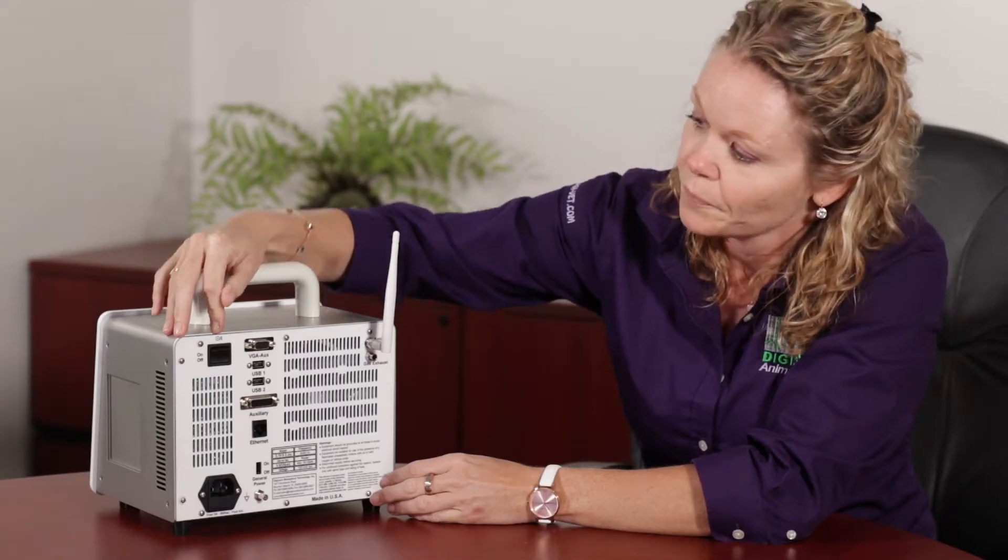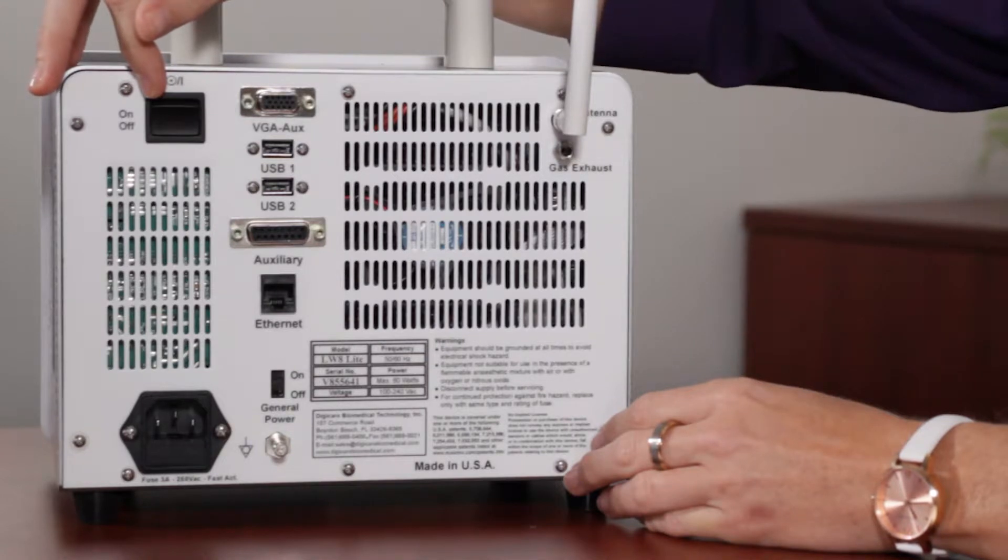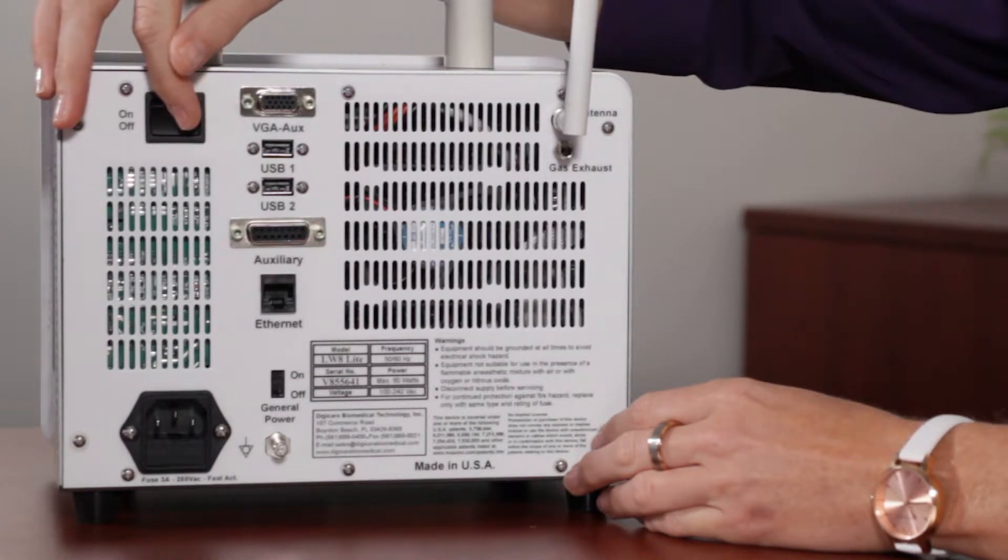The back panel of the life window. This is the on-off switch. This is how you would turn the monitor on. You do have to do a double toggle to turn the monitor on.